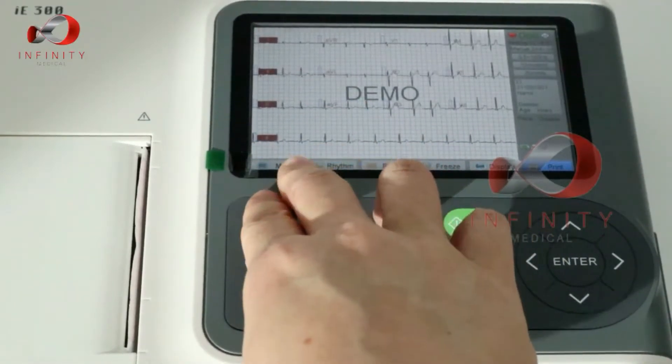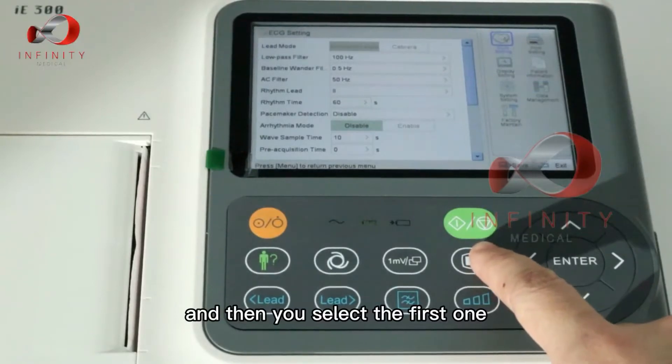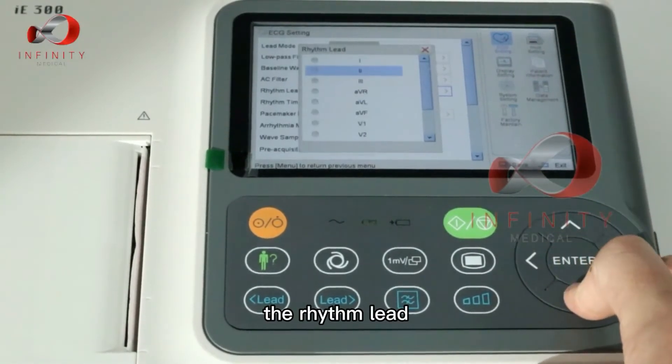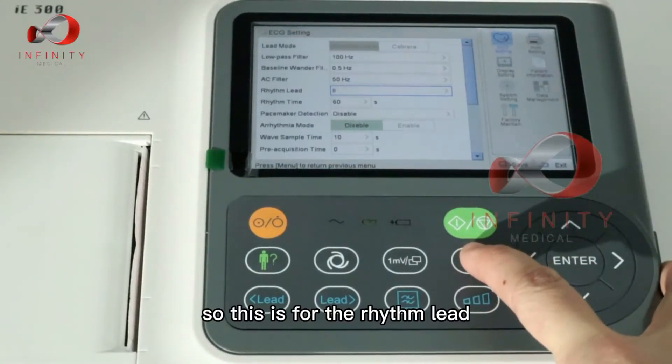To change the rhythm lead, go to menu and select the first option, which is ECG setting, then select. From there, change the rhythm lead to whichever lead you want.